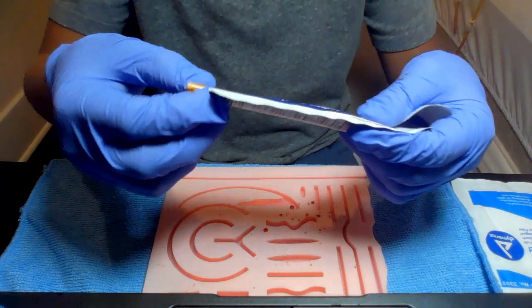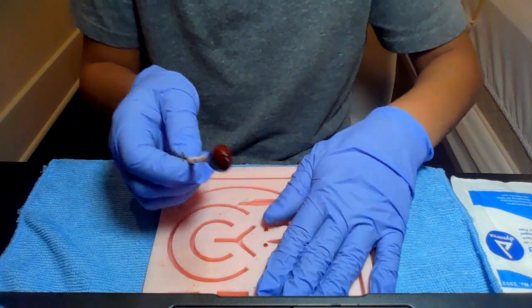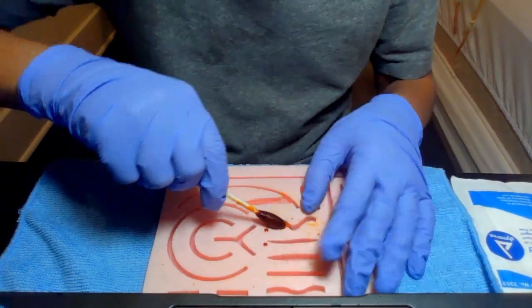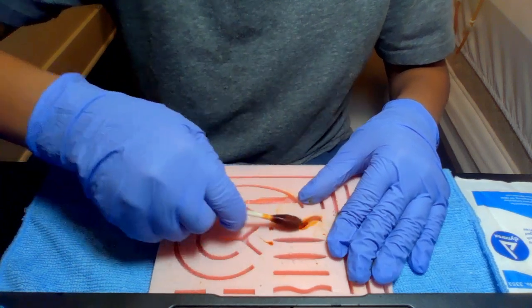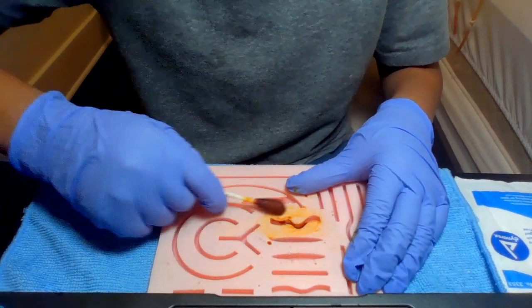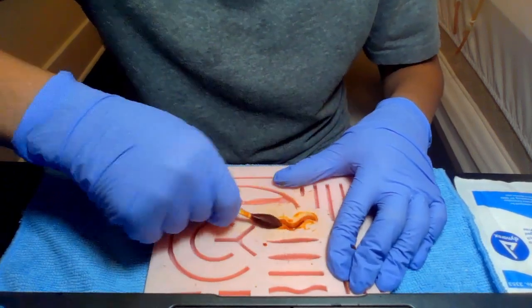Alright, so let's start. First of all, let's say we were going to suture this. What we would do is take an antiseptic like an iodine swab stick right here. Let's say we're going to suture this one. We want to go ahead and clean that wound. Now let's say we've already flushed it. We want to prepare this area in a sterile fashion.